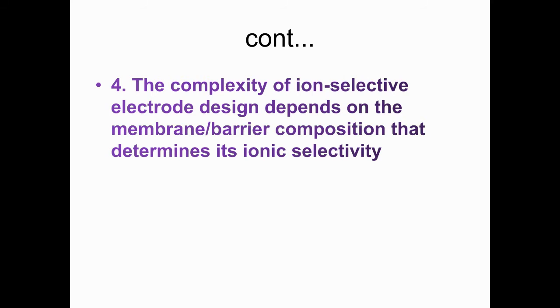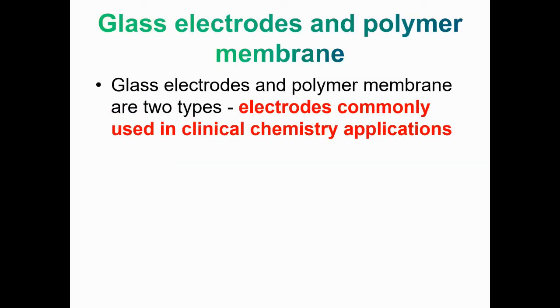The complexity of the ion selective electrode, as designed, depends on the membrane, the barrier composition, which determines its ion selectivity. Okay, and after that, it had been completed.